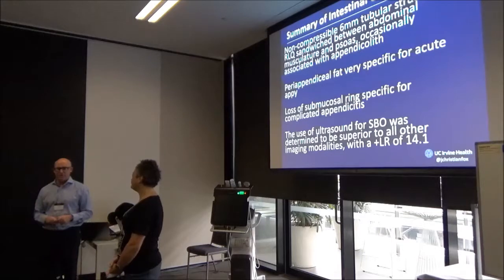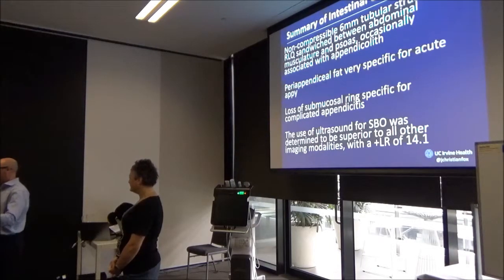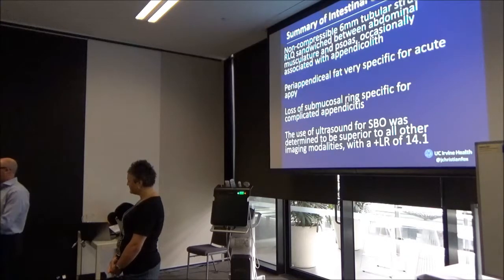Patient positioning is important. That's the other thing I didn't mention, is that I have the patient cross one leg over the other when I'm doing this. When you do an aorta scan, right, you have the patient bend their knees so you can push down really hard. When I'm doing an appendicitis scan, I have their legs crossed, so it kind of brings the contents a little bit more into an anterior-posterior plane, which is better for compression.